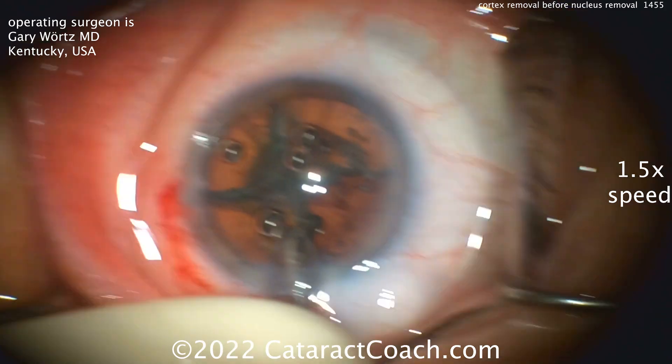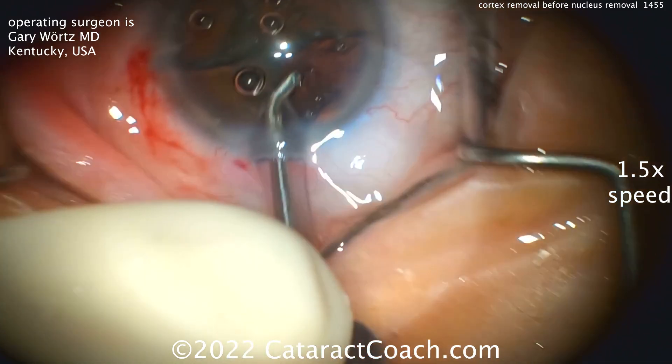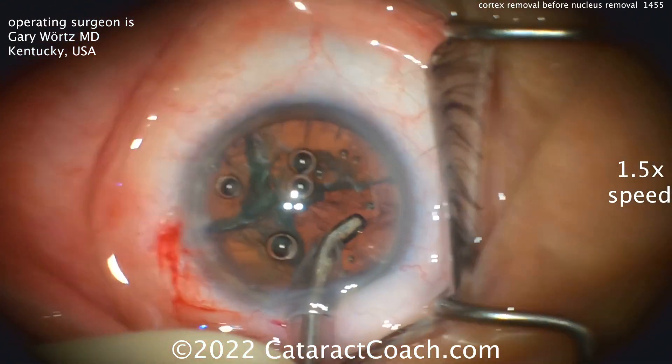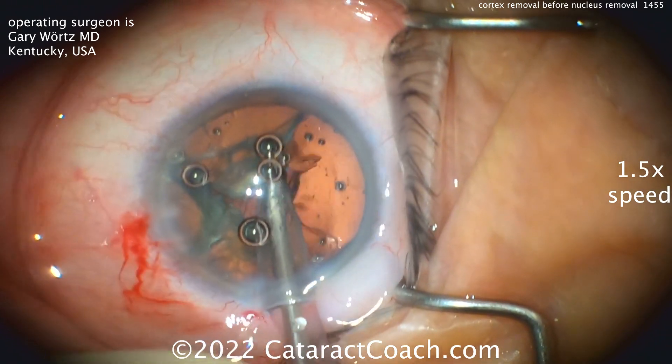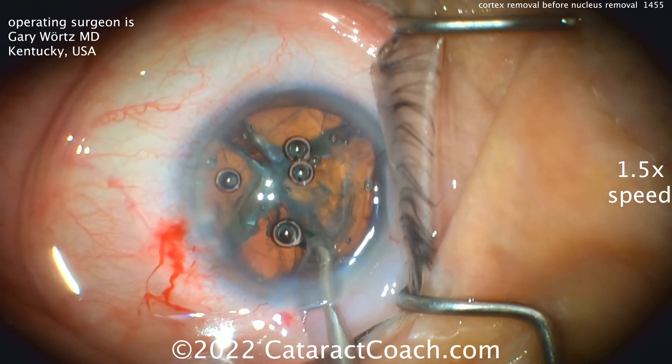I've never done this in more than 20, 25 years of cataract surgery. Never done this before. But this patient is all over the place — look at that movement. And then he's able to get this cortex out, leaving the three nuclear quadrants in the bag so far.